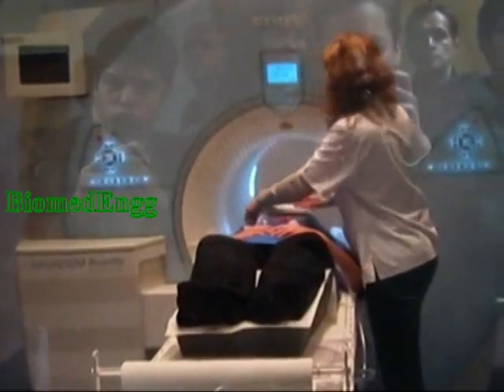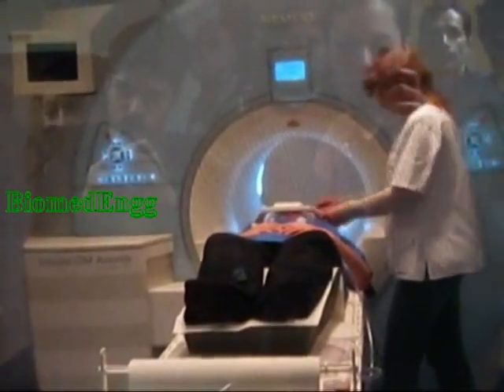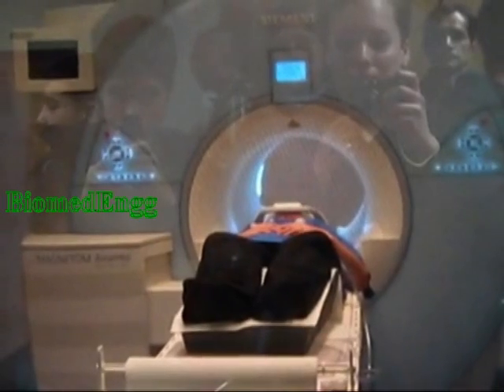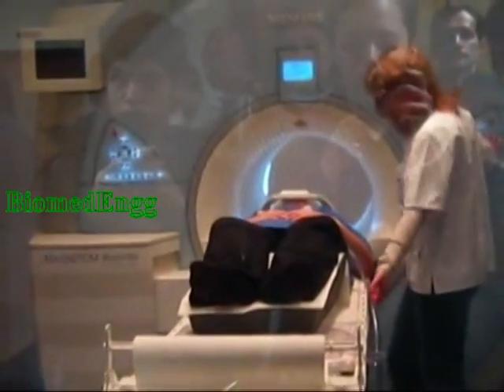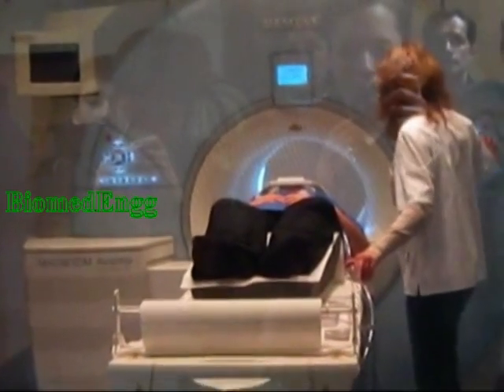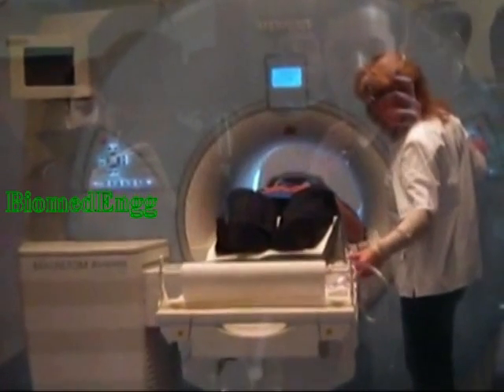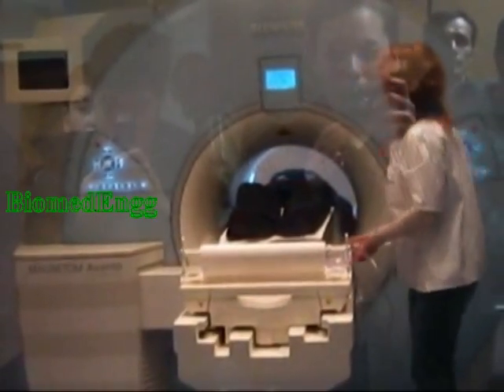The patient is now receiving an antenna that is placed over her cervical spine — the area that is to be examined. And now she is being put into the MRI. This is what it sounds like inside the MRI right now.